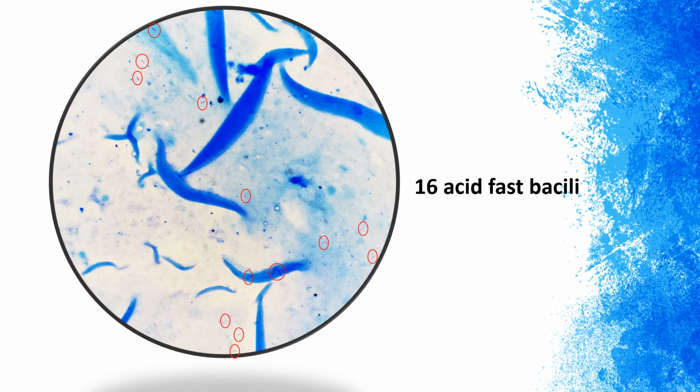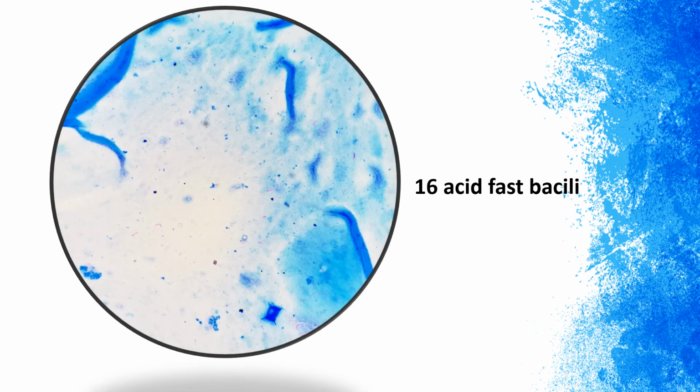So let's try counting in another field. Again, you have 30 seconds to count. And timer starts now. Ten seconds remaining.